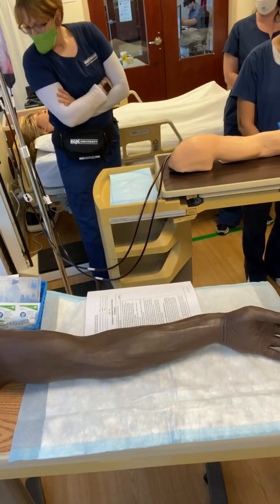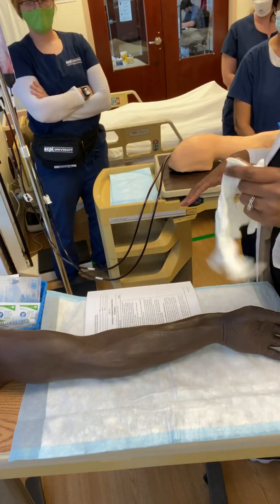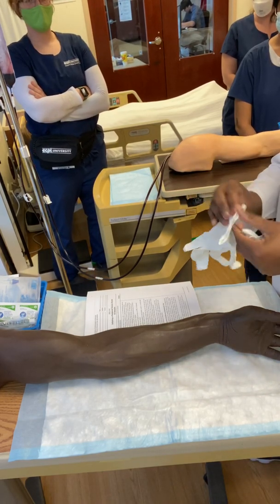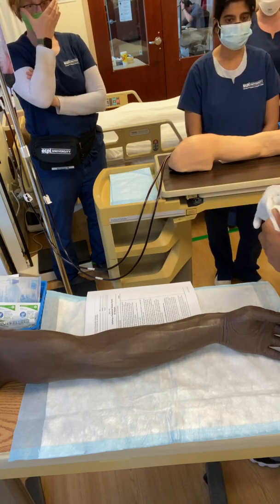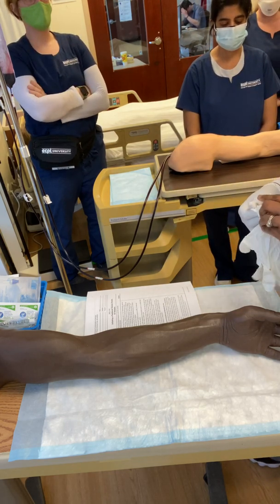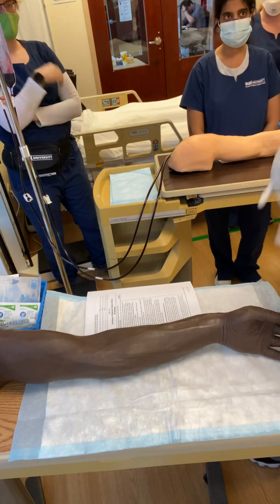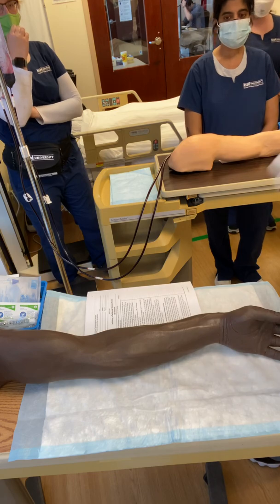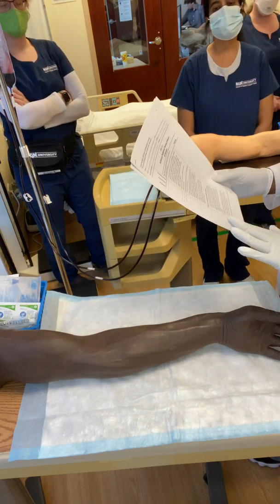So the first thing I'm going to do is, of course, wash my hands, okay? And I'm going to put on some gloves. All right, I'm going to look at my order, and I'm going to make sure that I have an order for IV insertion. Typically, when we have an order for IV insertion, they want to give the patient some fluids. So we're just going to look at our order. Okay, we got an order going on.